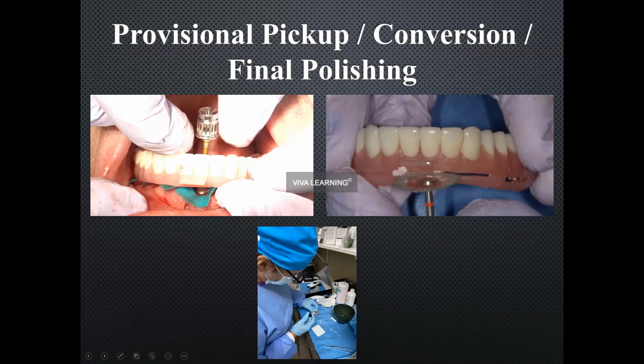Here's our provisional pickup conversion. Here again, we're talking about removing the handle and the flanges. I am taking this out of the patient's mouth. We've got little squares of rubber dam to keep any kind of pickup from going into an undercut.